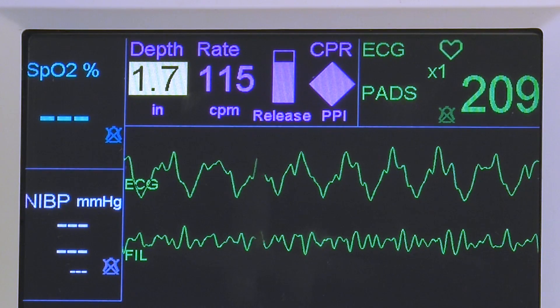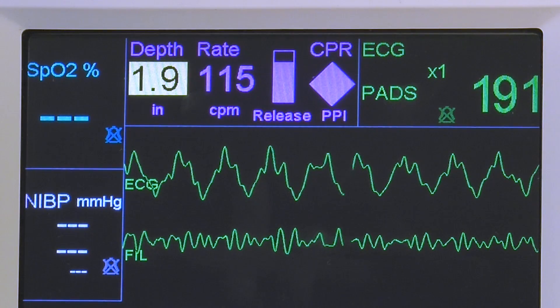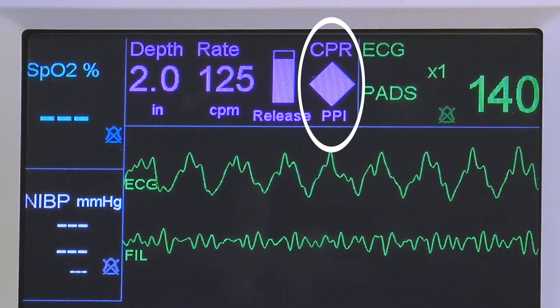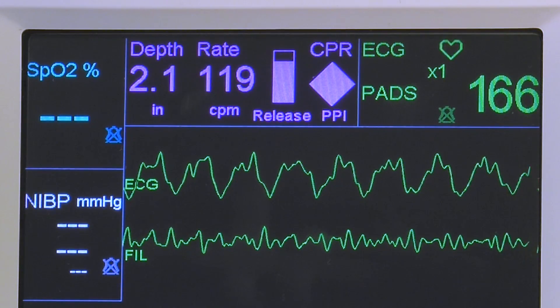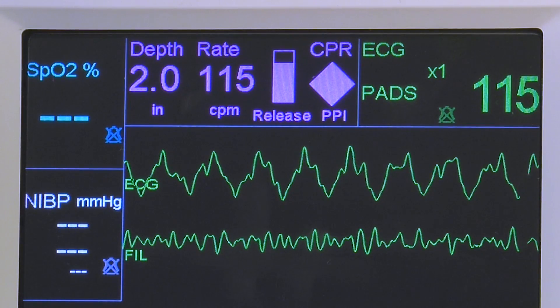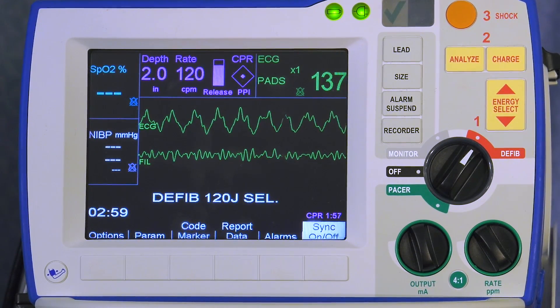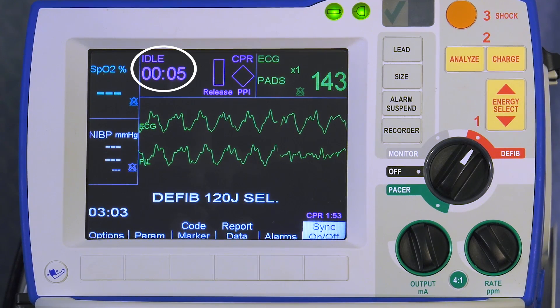If the color begins to decrease, quickly lift hands off the chest for better recoil. The perfusion performance indicator integrates compression depth, rate, and interruption times into one visual indicator. Keeping the diamond-shaped PPI full provides visual indication of performance to the current guidelines. When compressions have been interrupted for an extended period of time, idle time is displayed in minutes and seconds as a visual reminder to help minimize pause time.